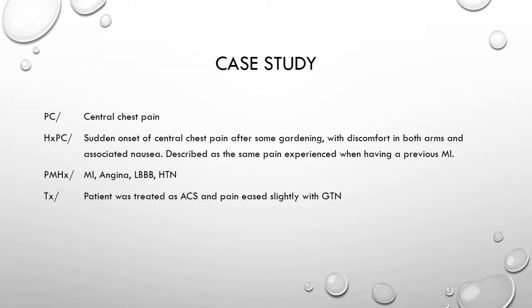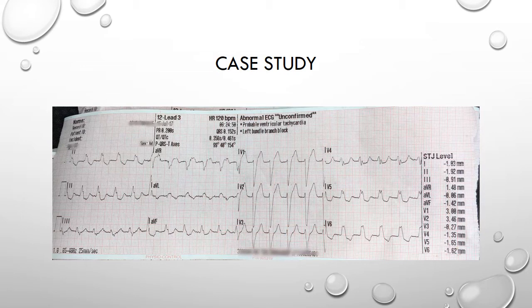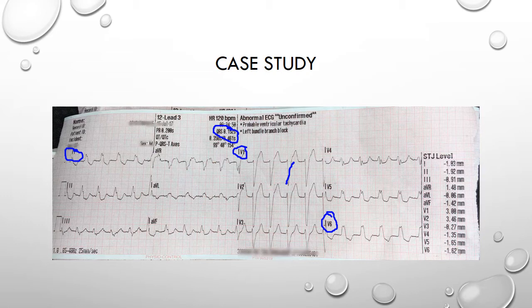Here we have one of the initial 12 Lead ECGs recorded by the crew, and we can clearly see it is a left bundle branch block, correctly interpreted by the computer. How do we know it's left bundle branch block? If we look at the QRS complexes in leads V1, V6 and lead I, we can clearly see left bundle branch block morphology. The QRS duration is wide at more than 120 milliseconds, and we've also got a dominant S wave in lead V1 and absent Q waves in both lead I and lead V6.